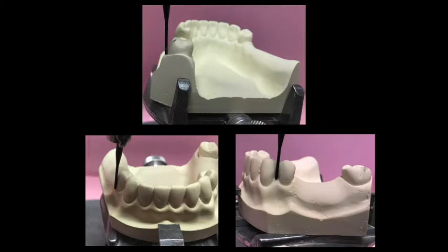That's a tricky case you will have at the beginning. When you use the KISS principle manual and want to find the undercut on those three teeth, you find you are not able to find any. Because this molar, number 18, is lingually tilted. And we know we need to have an I-bar on 28.